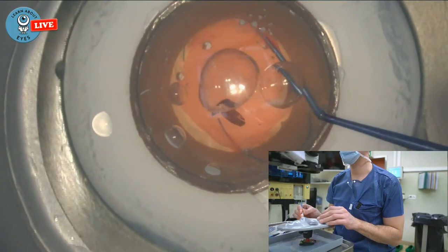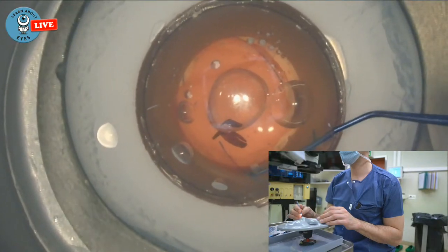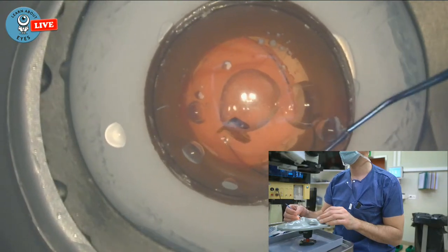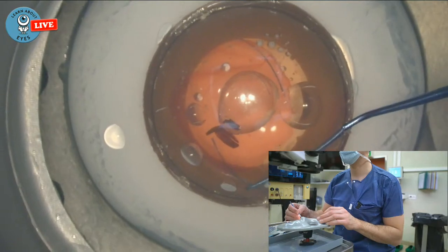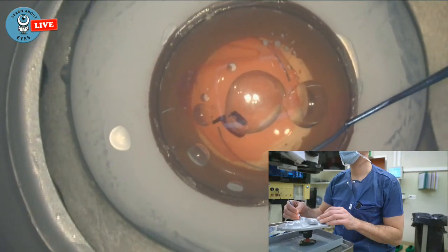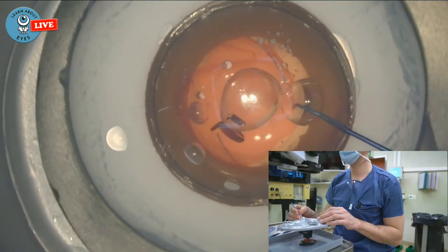And again, it's hard to get back out. Okay. Oh, that made a huge difference using the Sinskey instead of the spatula. I guess there is a right and a wrong tool for that. Okay. Guess that's pretty good.